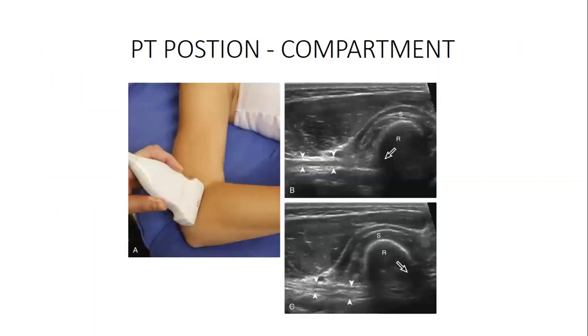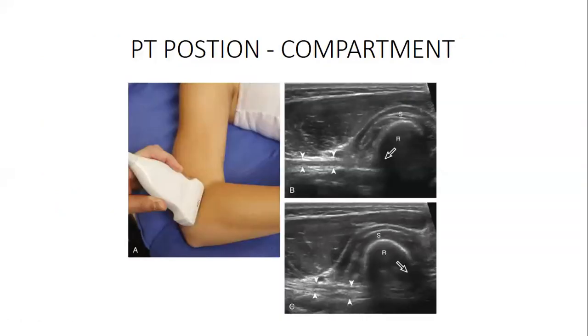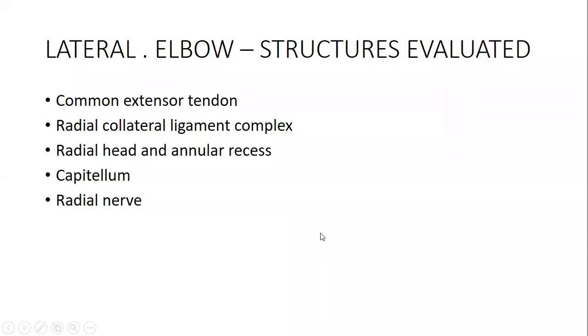This is how you can position. I think you can see this is very simple. This patient was in supine, but you are trying to look specifically at the lateral portion. Please don't just check things. Look for specific things: the common extensor, the radial collateral ligament, and the rest. This is how you do it. When you look at these specific things, you have to know that what you are seeing here is the capitulum. This is the capitulum, and this is the muscle, and we are not checking the muscle. If you look here, there is no muscle here. So don't concentrate on things that are not there.